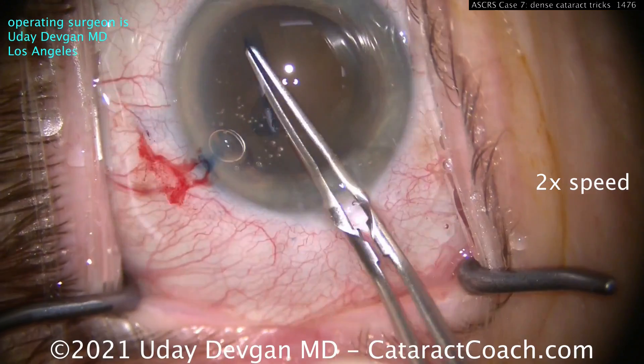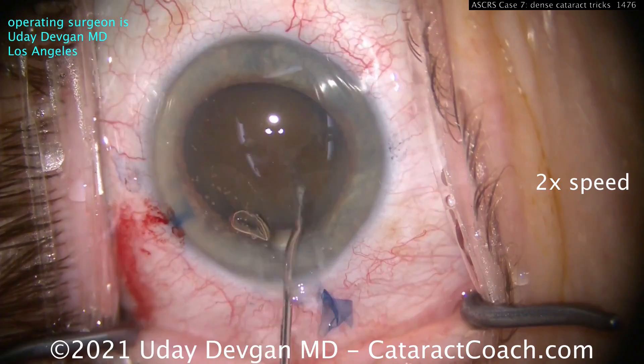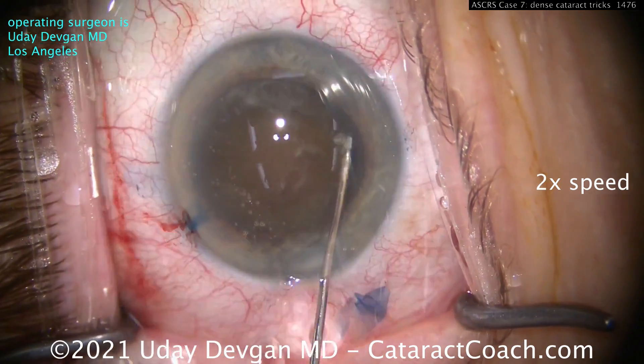We've got a dense cataract here. Pearl 1: make that rhexis big — at least 5mm, maybe even 5.5, I don't even mind 6.